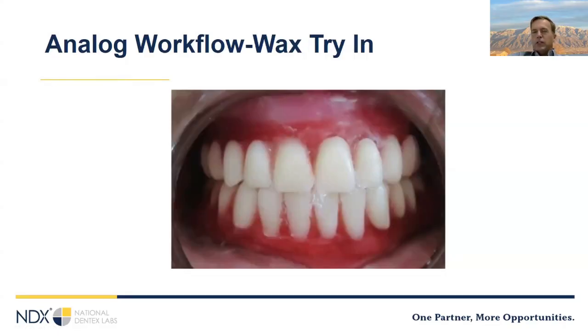Obviously, your next appointment's your try-in. One of the challenges with a traditional workflow is that the base plates that are made for the bite block and the try-in fit similar to your final denture, but they don't fit exactly the same.